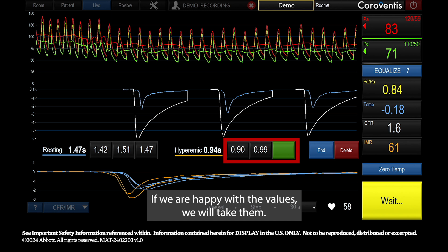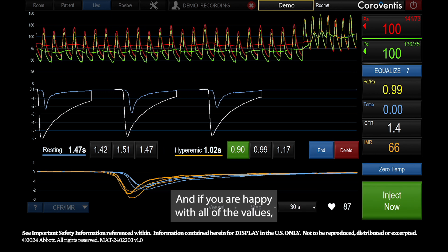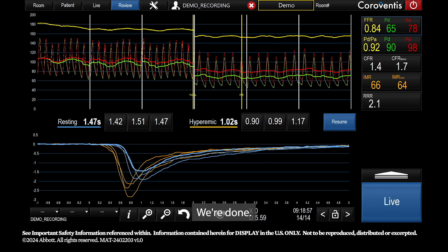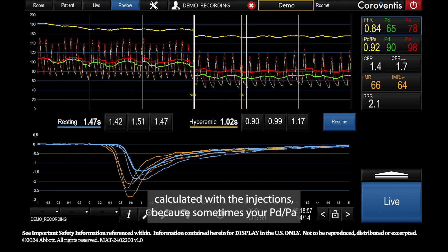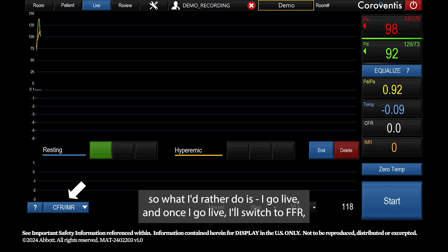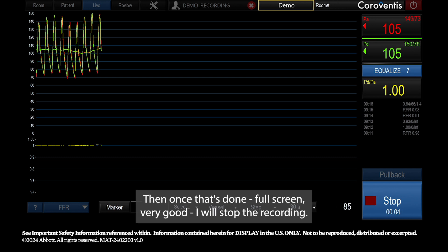If you're happy with the values, you can replace, edit, or delete them — just click on the value and delete or replace it. I usually don't take the FFR value calculated with the injections because PD over PA can be inconsistent during injections. Instead, I go live, switch to FFR, and record while adenosine is still running for at least 10 seconds.